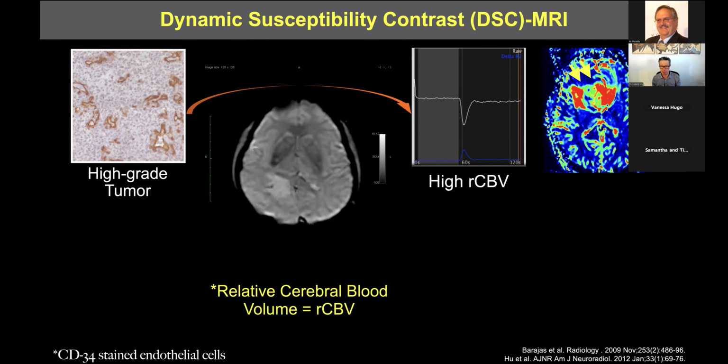So anyways, we're all motivated in the field of advanced imaging research to use techniques besides conventional contrast enhanced MRI to help improve diagnostic accuracy. And I'm sure if you all have tuned in to these talks and have had Kathleen Schmainda on as a guest speaker, you are probably very familiar with the technique dynamic susceptibility contrast, or DSC perfusion MR. And we have basically been trying to develop this technique and validate it to bridge the diagnostic gap.